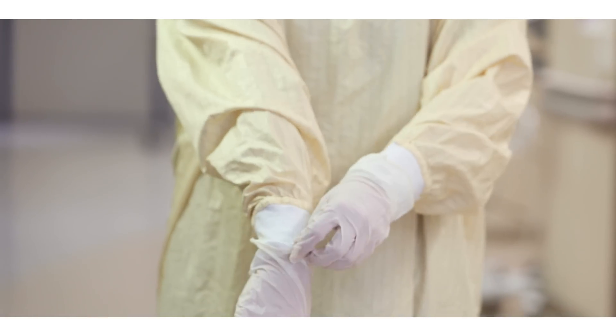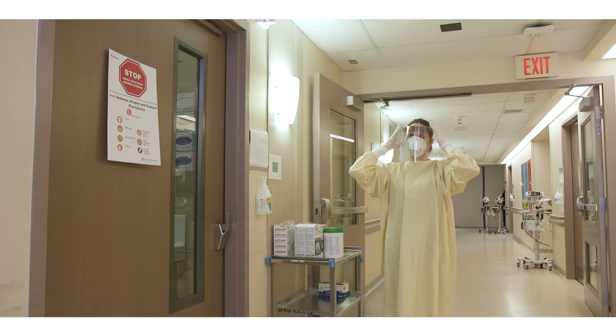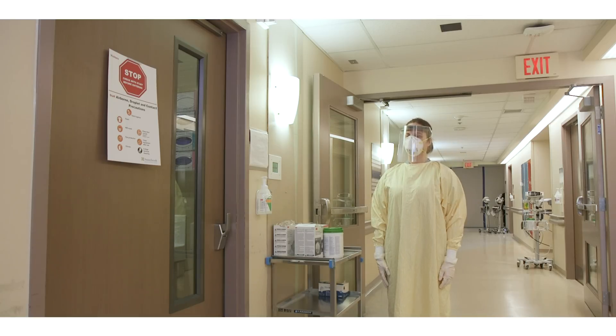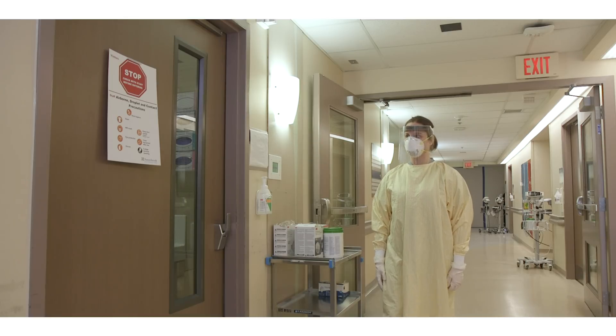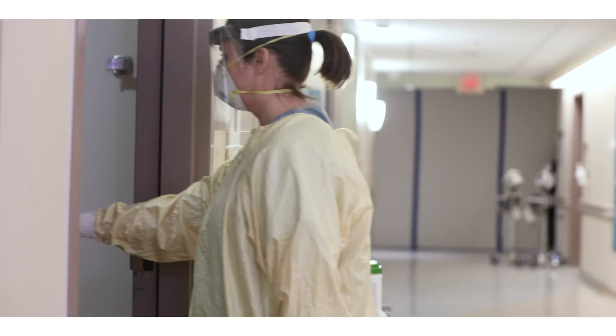Perform a final personal protective equipment check prior to going into the room. Alternatively, have a colleague perform the final check. After entering the patient's room, keep hands away from your face. Only open one door at a time to maintain negative pressure in the room.